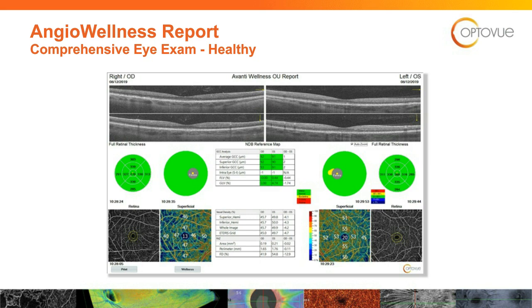We were able to do GCC and the B scan, but you can see down there at the very bottom, there's 5 boxes. The 2 at the very bottom on the outside left, outside right, that's your angio view. You can see there's 2 little yellow circles in there. That's giving you your foveal avascular zone. And what we're doing with that is really looking to see how round, make sure it's not oblong, and there is some numbers in that middle box there showing that there's excellent symmetry.